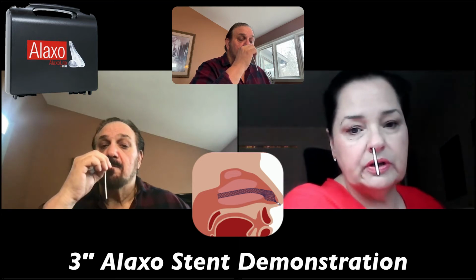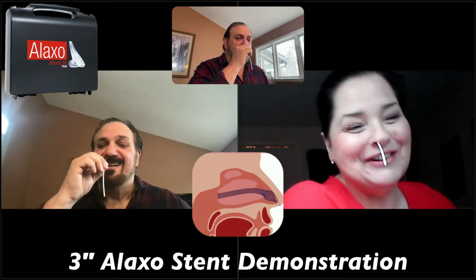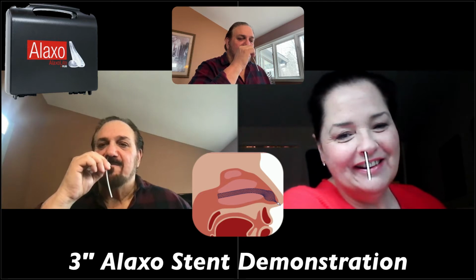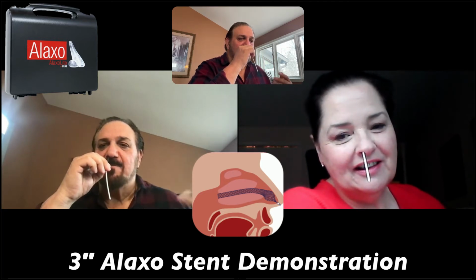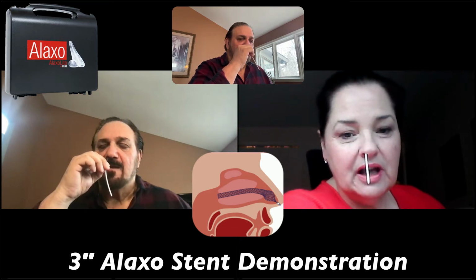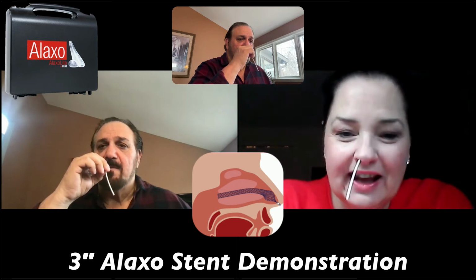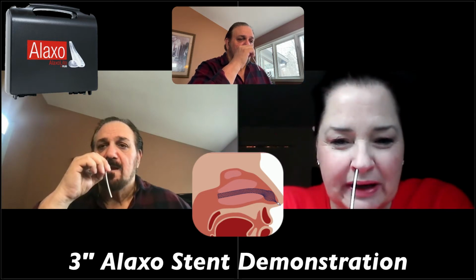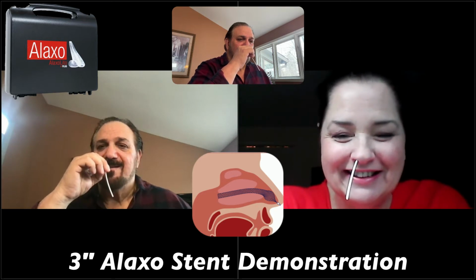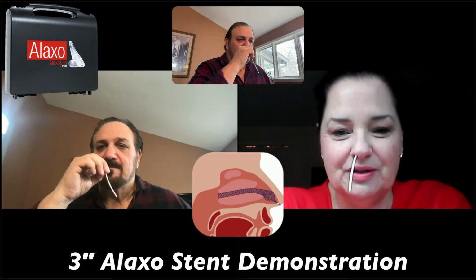You're aiming towards your earlobe. Yeah, I'm trying to. I know. I'm reacting to my body responding to this. Absolutely. And you know, some people will just... It doesn't hurt, but it's a little tingly feeling, like you say. It's a little tingly. Your nose gets a little runny. Yeah. Talking makes it a little more tingly. Sneezing. Yep. Absolutely. You will feel like sneezing.